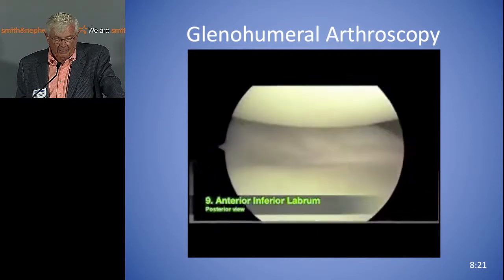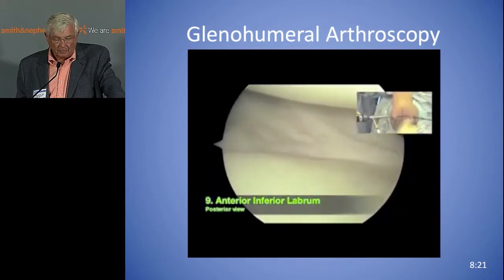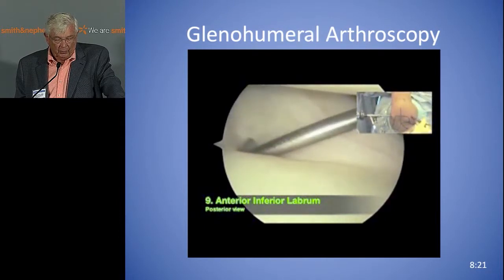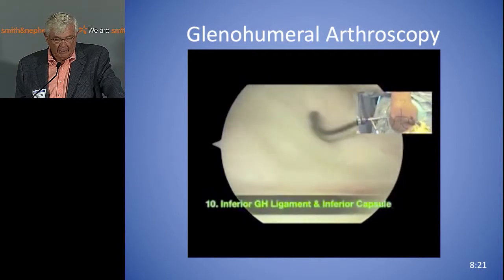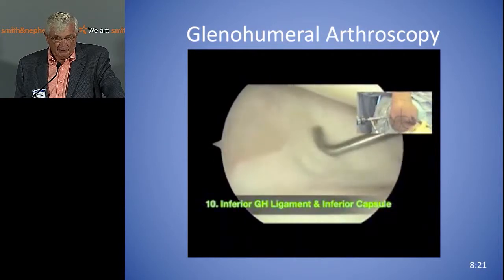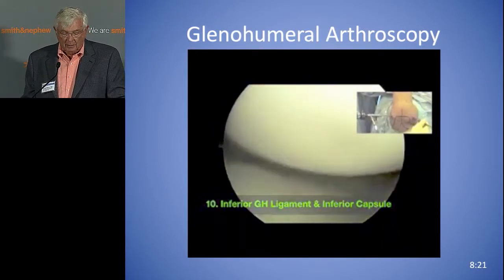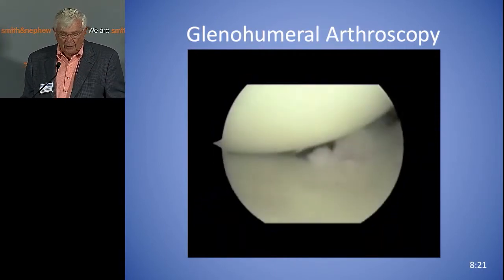So now you're coming back down to the inferior labrum, and you're looking at this from posteriorly. You can probe here. You can put your hand in the axilla and lift up with one hand. Dr. Arland showed how to put a roll towel in the axilla.